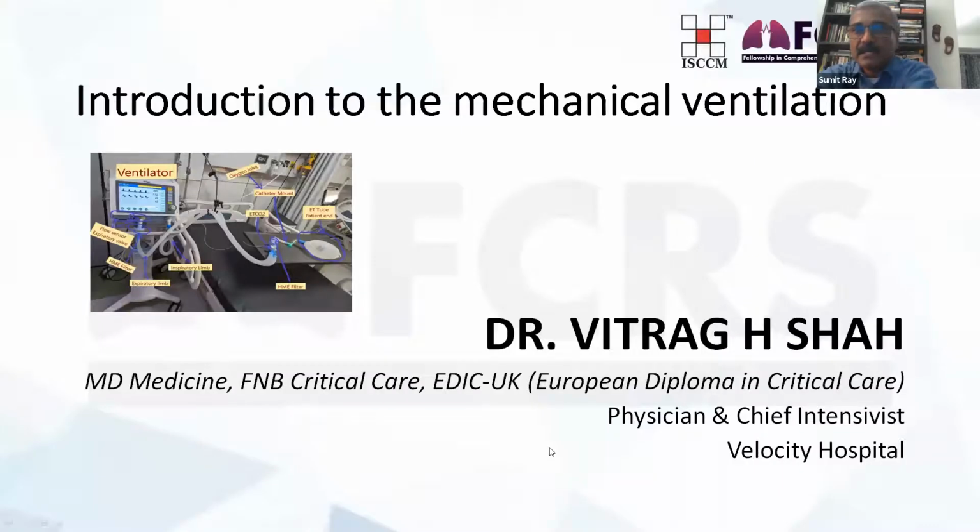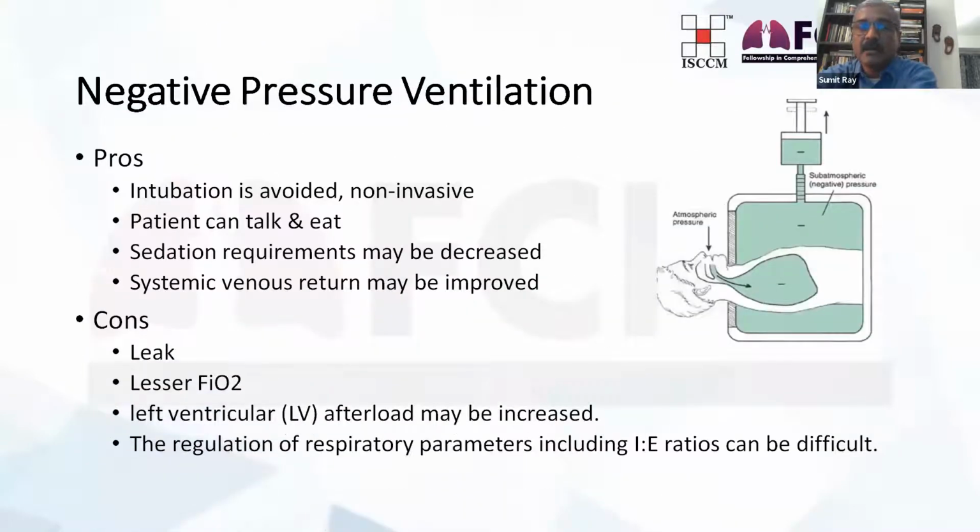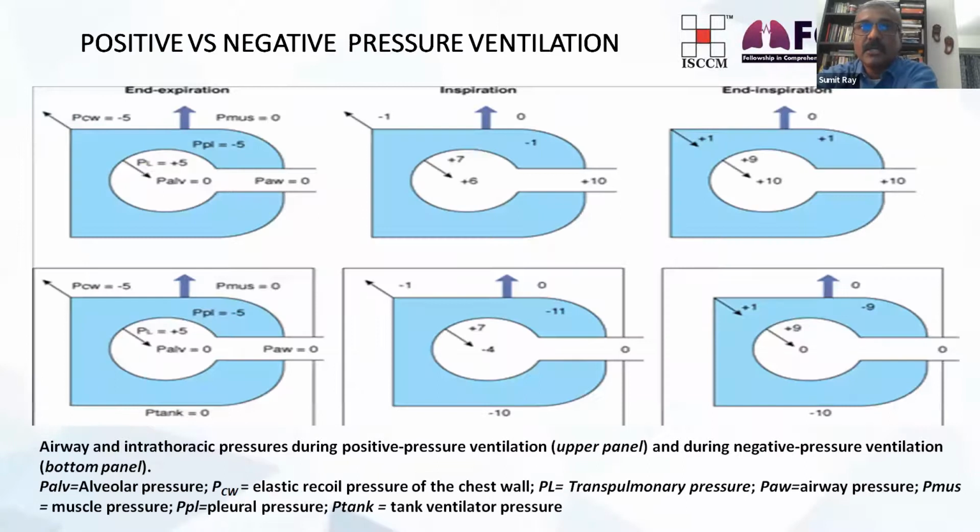These were the two large pathways that positive pressure ventilation developed in, along with the role of PEEP in both major forms of lung disease, either the ARDS pulmonary edema end, or the COPD bronchial asthma end. This would be the major target of change that you are looking at.